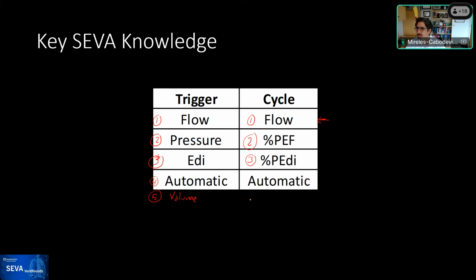I don't know if volume per se, Rob, is that also used to cycle? Oh yeah, absolutely. In fact, the Servo ventilators, you set a tidal volume and it cycles off. The Drägers are like that too, I think. And if the flow is higher than necessary to deliver the volume, then you get an inspiratory hold.